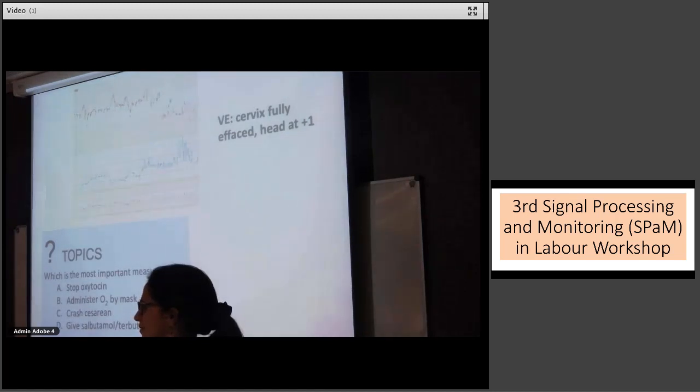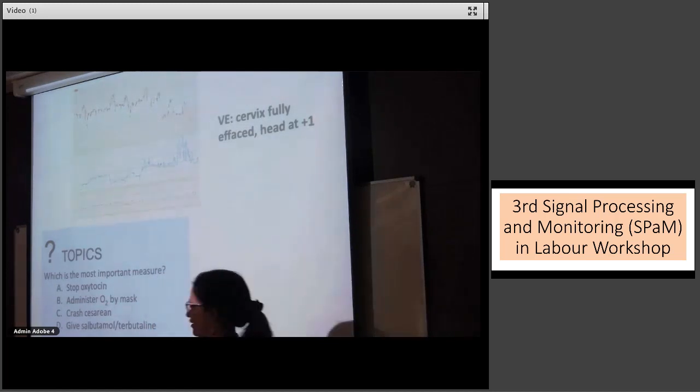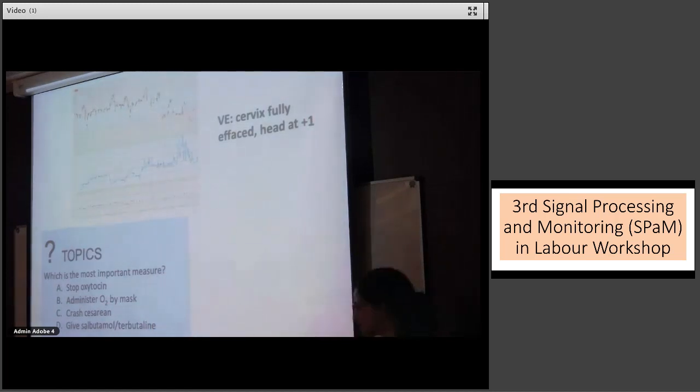Right. Thank you. Diogo. Yeah, well, I would also stop oxytocin. Would you administer oxygen, by the way? On your way to... The answer is I'm not. It's not clear that it's going to work that fast, if at all. What do you think the mechanism is?